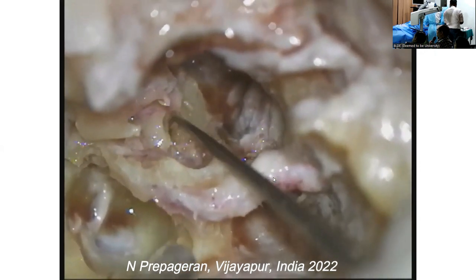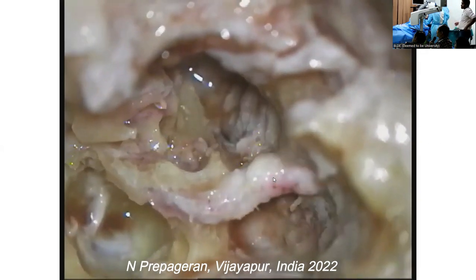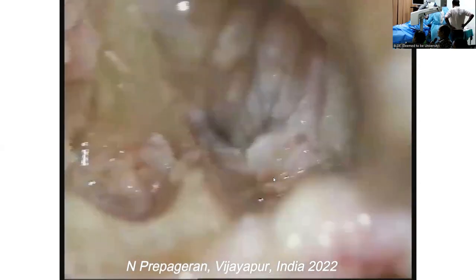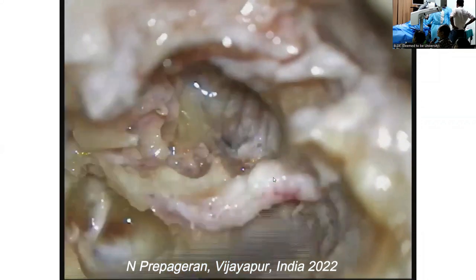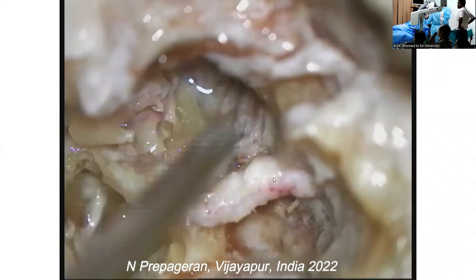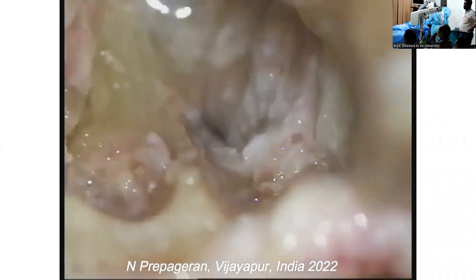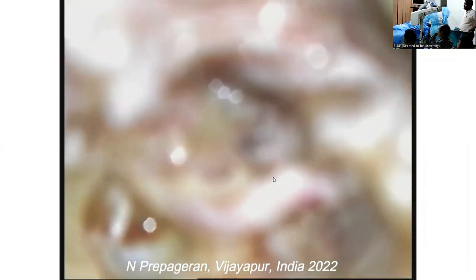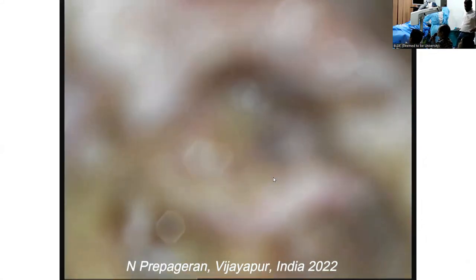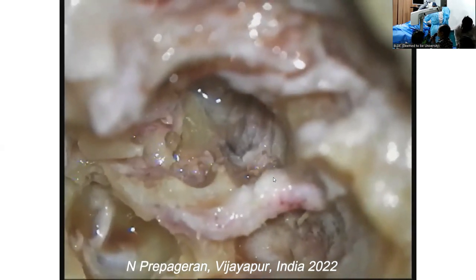Okay. Lift it up. Scala vestibuli down here. Okay. Can we zoom in, sir? I'm going to zoom. Okay. You want more zoom, is it? This is too high, no? I think we are comfortable with the previous magnification only, sir. Okay. Wait. I think we are comfortable with this.